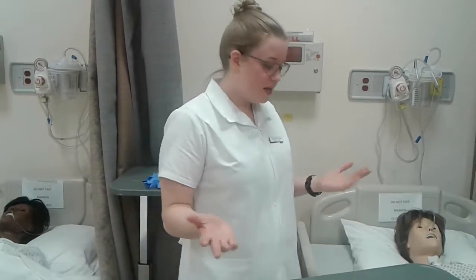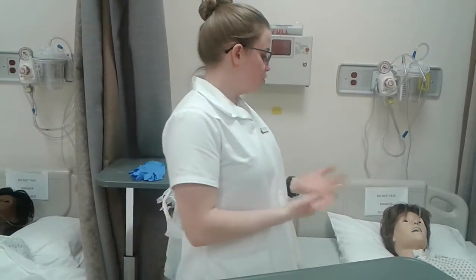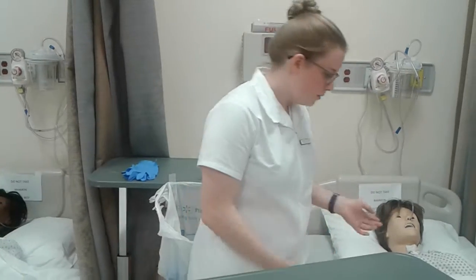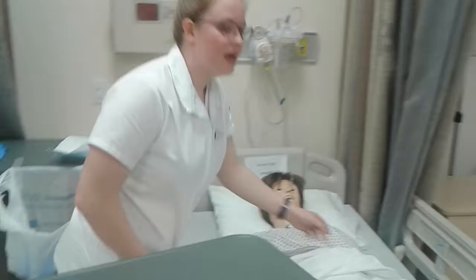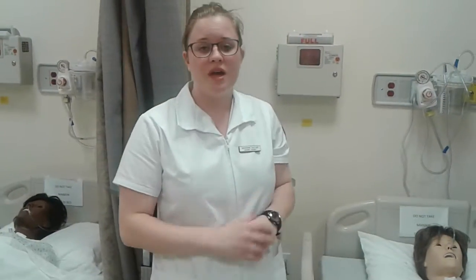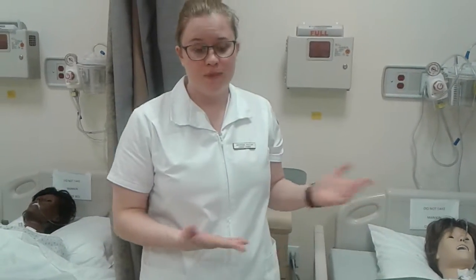So to begin, I would obtain my physician's orders, wash my hands, gather my equipment. I would introduce myself to the patient and identify her. I would ask her to state her name and date of birth and compare it to her ID bracelet. I would also provide privacy and explain the procedure.